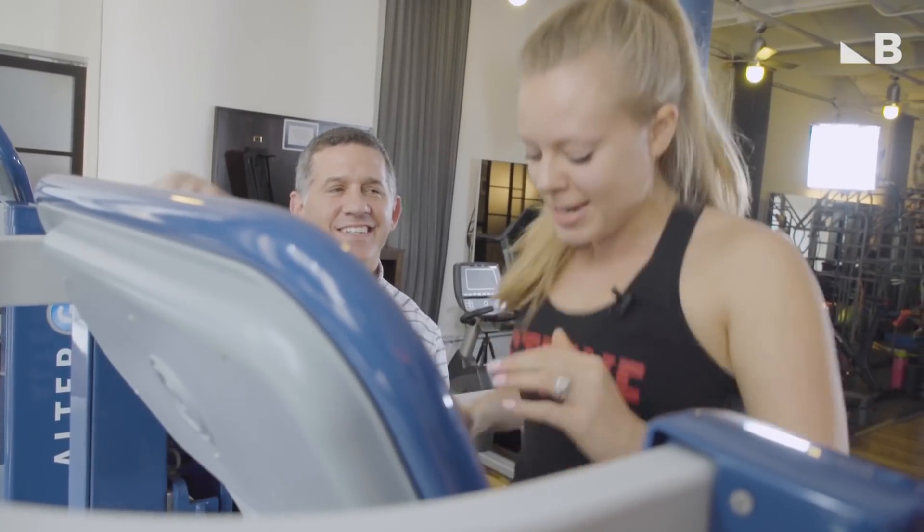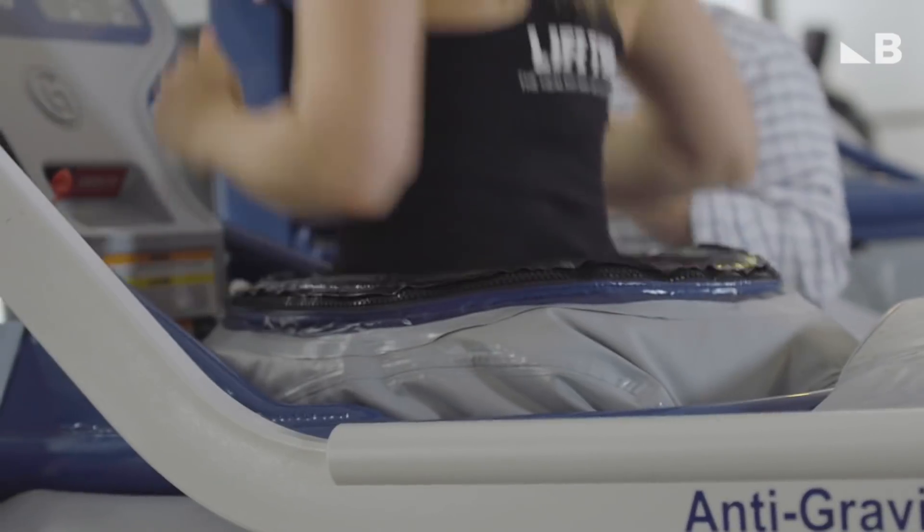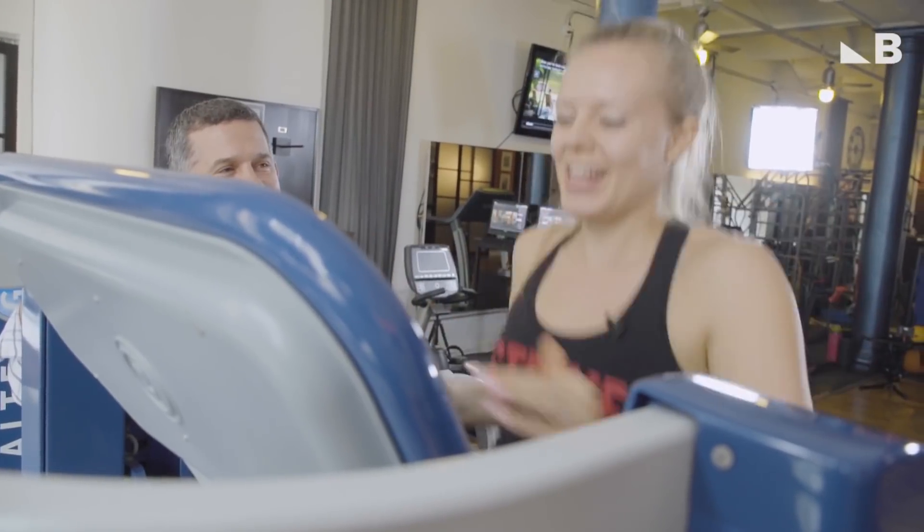Run and then you can tell me. I guess running on clouds would be a good description — it's not like water because there's no resistance. It's like I'm leaping from cloud to cloud.